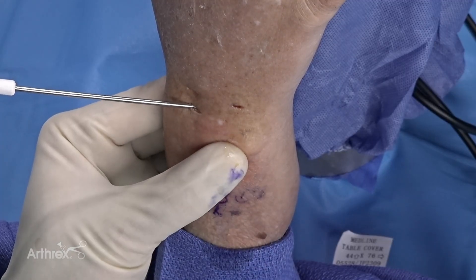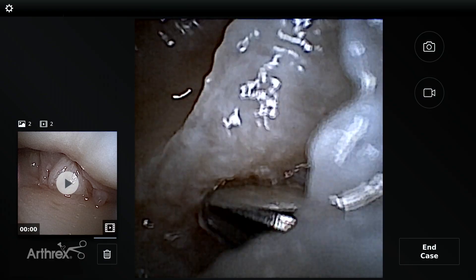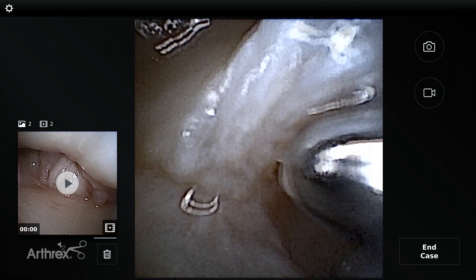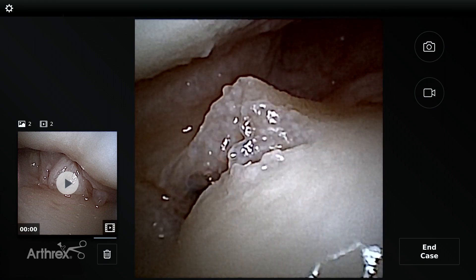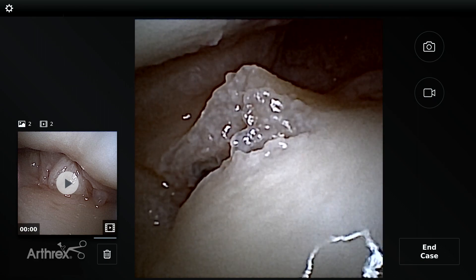Now I've introduced the nanoscope trocar and cannula system. You can see it's blunt, and I'm underneath the TFCC — this will now allow us to get into the DRUJ. I know I'm in the right place at the right time. There's minimal fuss and no guesswork; all the guesswork has been taken out by looking at our portal of entry using the nanoscope.